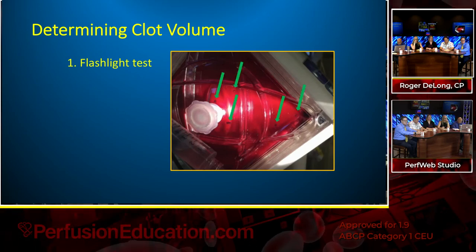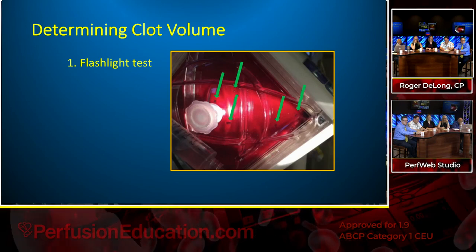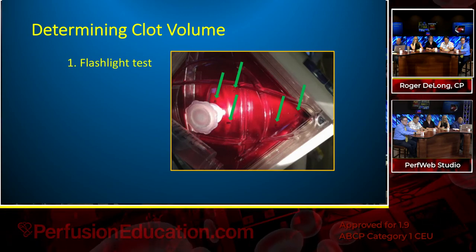In this one, there's a tiny little amount. There's 5 different flecks that you can barely see. Okay, I see the flecks. Now what do I do with that information? Not very quantitative. Next.